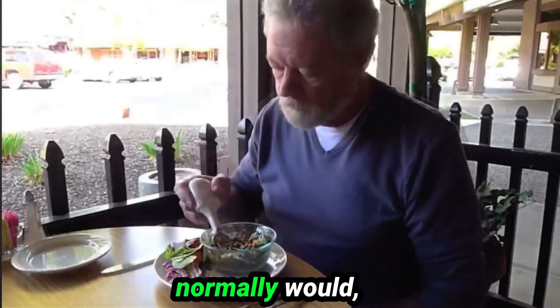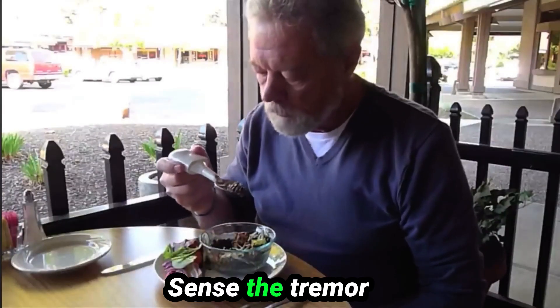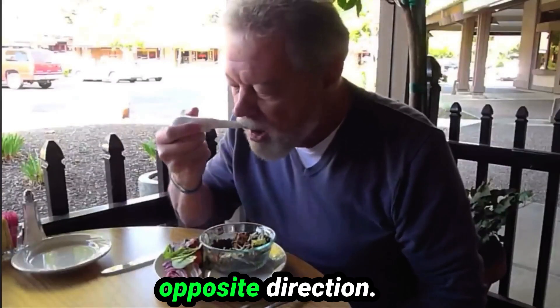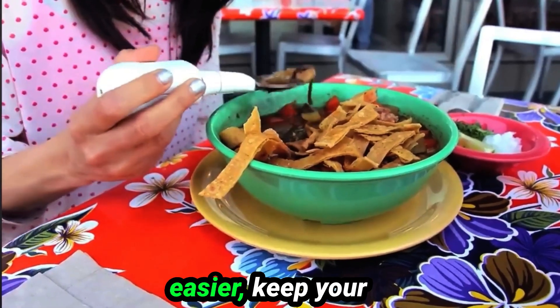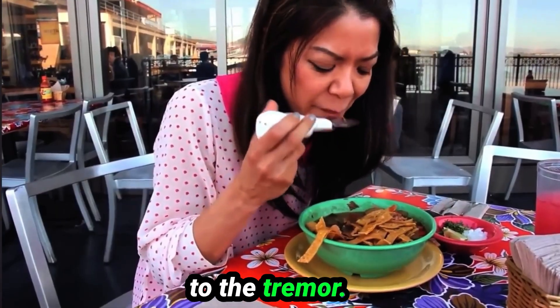Just grip and use the spoon as you normally would and allow the tremor to occur. The sensors in the handle sense the tremor and move the utensil in the opposite direction to make eating easier. Keep your fingers clear from where the handle and the attachment connect, otherwise it won't be able to adjust to the tremor.